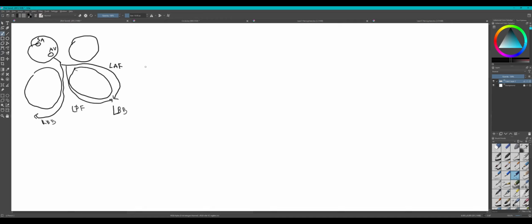All right, so if we're going to do a QRS, let's draw this kind of big. Here's the P wave. Here's the PR. Here's the QRS. And here's the ST segment. And here's the T wave. Now, when the sinoatrial node fires, it's here. So this is the sinoatrial node. When it goes across, that's this entire portion. Sorry, atrium. So this is when the atrium contracts.